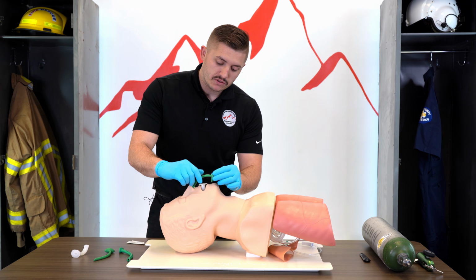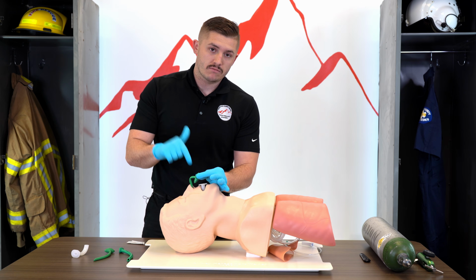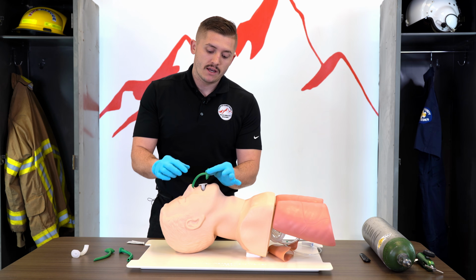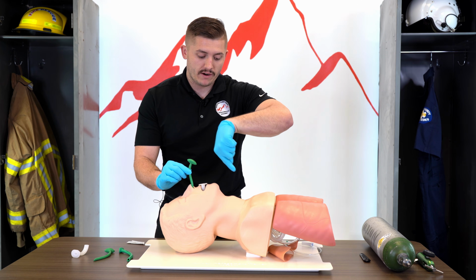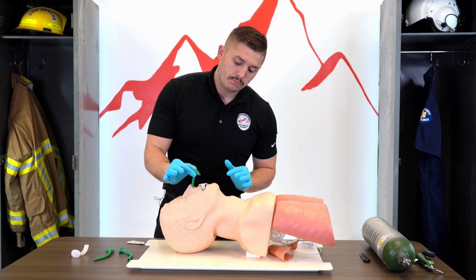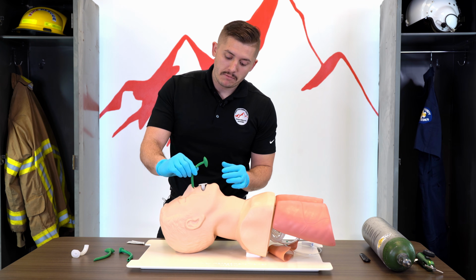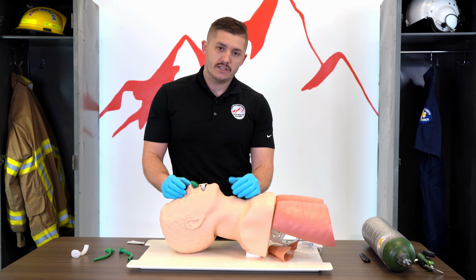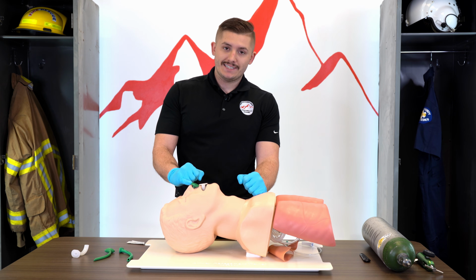One thing a lot of people will do as well is they place it in the nose and they think if they just push up, it will then just naturally go into the right spot. This is something I had trouble with a lot as a new EMT. One thing I figured out and how it works very well is that the naris kind of goes down this way behind the oral pharynx. So we're going to push straight down, just like that. Again, this mannequin has perfect nostrils, so it's going to be a little more difficult on an actual patient. But if you can remember that rule of bevel towards the septum and placing straight down, patient should accept. Even if they have a gag reflex, they will most likely still be able to accept an NPA.